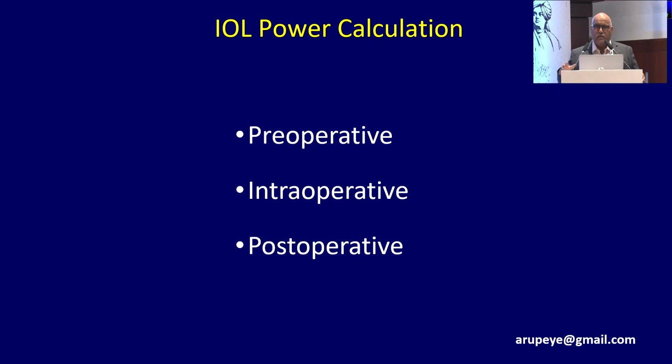I have already mentioned that I'll be talking about the SOPs that I follow. My SOPs basically depend upon what refractive outcome I'm getting in a particular year, and then what new things have come up in the literature, new suggestions and new tips, which I incorporate. So my first tip would be, please don't consider IOL power calculation as just a one-off event in the workup of the cataract patient. It pervades the intraoperative period as well as the postoperative period.